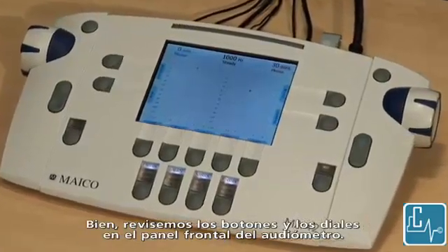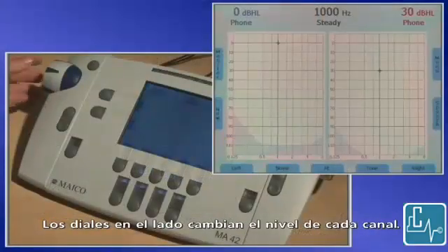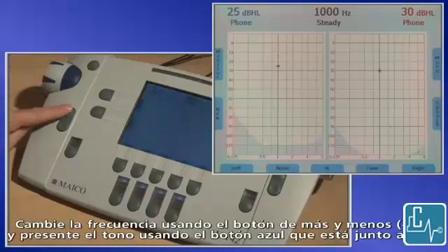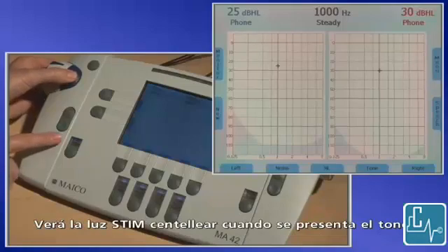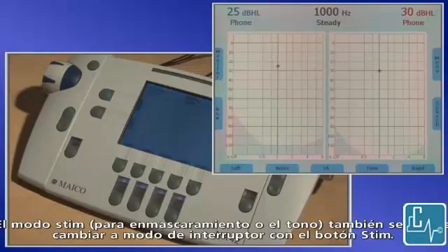Let's review the buttons and dials on the front panel of the audiometer. The dials on the side change level for each channel. Change frequency using the plus and minus button and present the tone using the blue button next to the dial. You will see the stim light flash when the tone is presented.